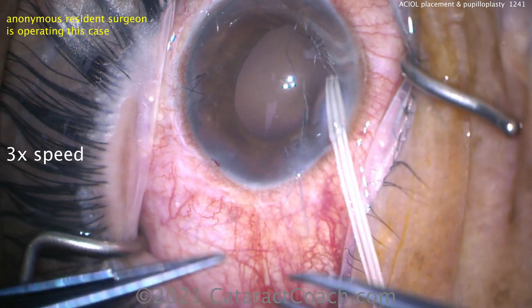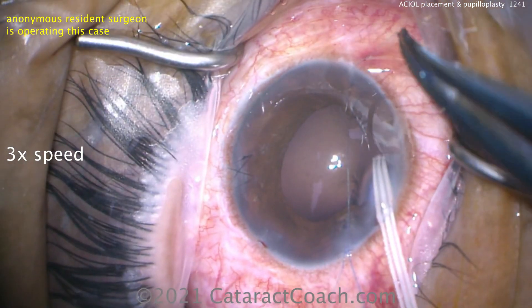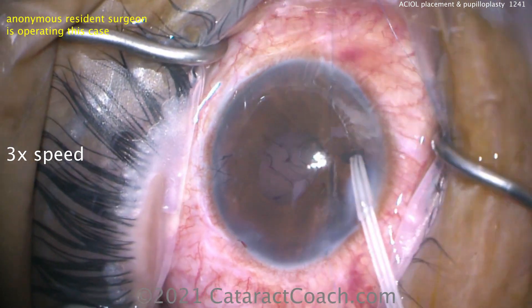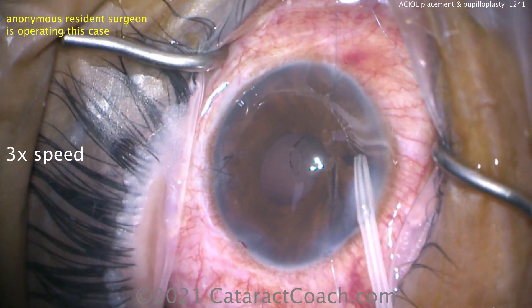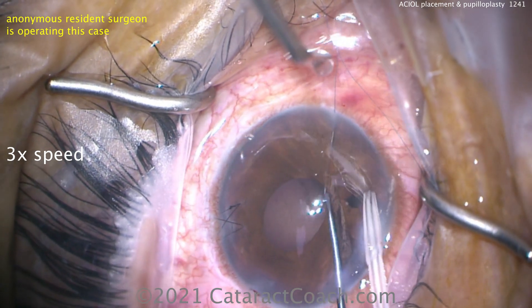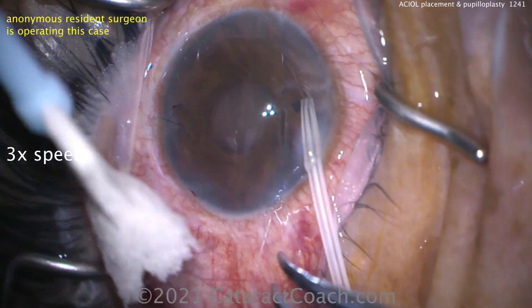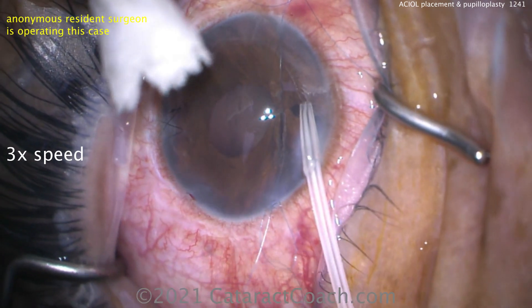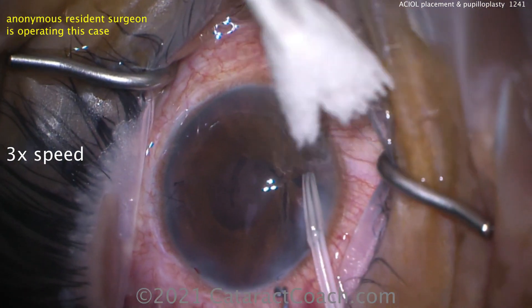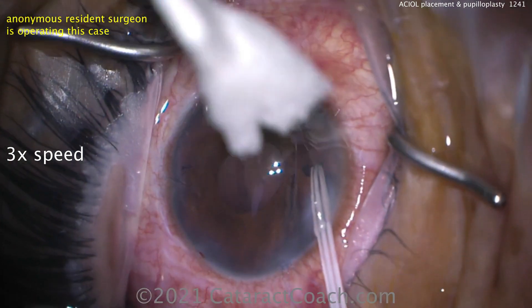After the suture has passed four times — one, two, three, four throws through that loop — the two ends can be pulled apart and the knot will automatically be brought inside the eye and it can be closed. Look at that defect. So this is the patient without dilation. The inferior iris is the one that is not working; the rest of the iris does tend to work. This pupil size is just about perfect. The patient ended up dilating post-op to about 4 to 4.5 millimeters, which is very sufficient for a good retinal view. It's going to take one more suture right where the tip of the AC maintainer is, and once that extra suture goes in, the iris will be closed quite nicely.